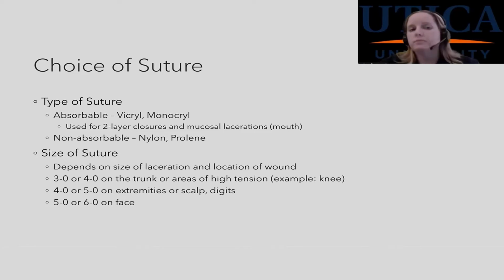So now that we've determined absorbable, non-absorbable, how do you determine which size of suture? It depends. Where is it on the body? Is it over an area of high tension? Is it on the extremities? Is it on the scalp? Is it on the face?